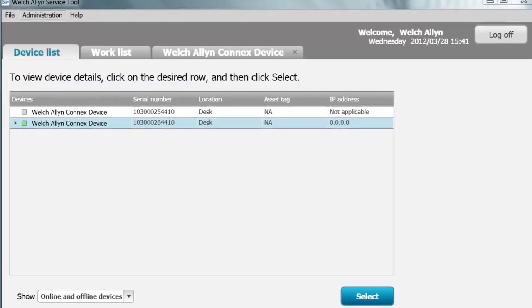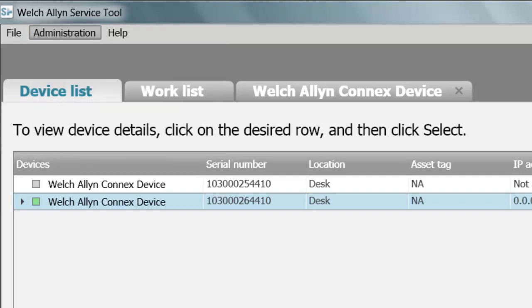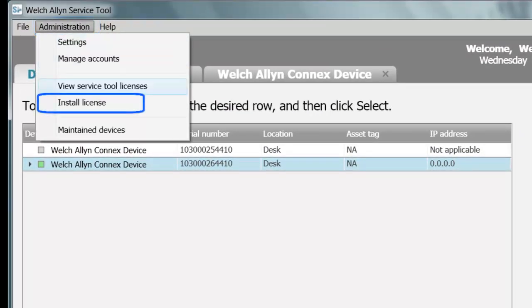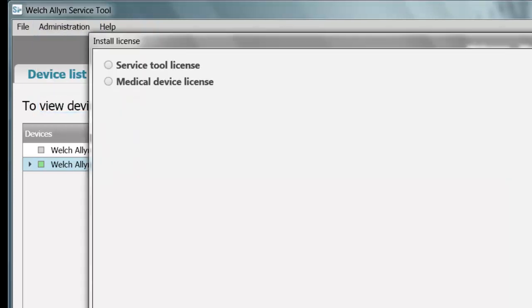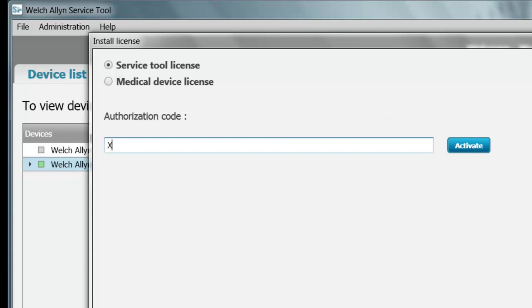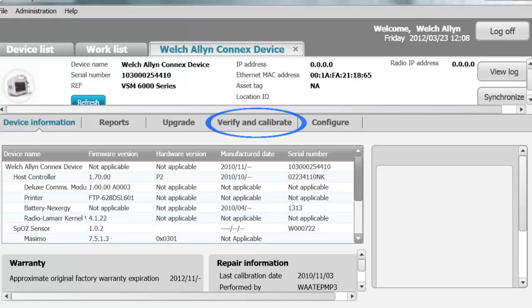You can also view your package by clicking on Administrator and selecting View Service Tool Licenses. A pop-up will appear with all Gold licenses and their expiration date. To activate the Gold license, go to Administration, Install License, and select Service Tool License. Input the authorization code provided from your training and click Activate. The Gold license will install, and the Service Tool will confirm the license is activated. The Verify Calibration tab will now become available for the device.